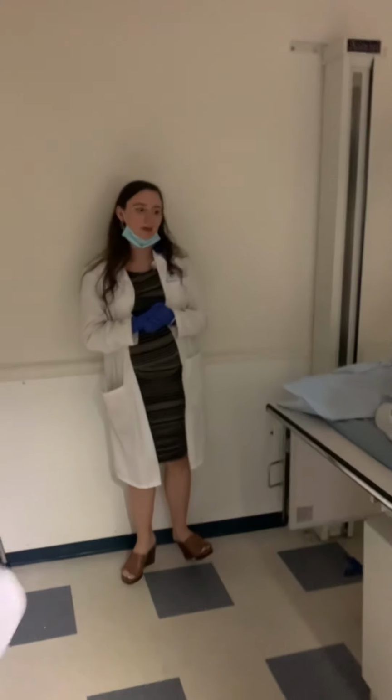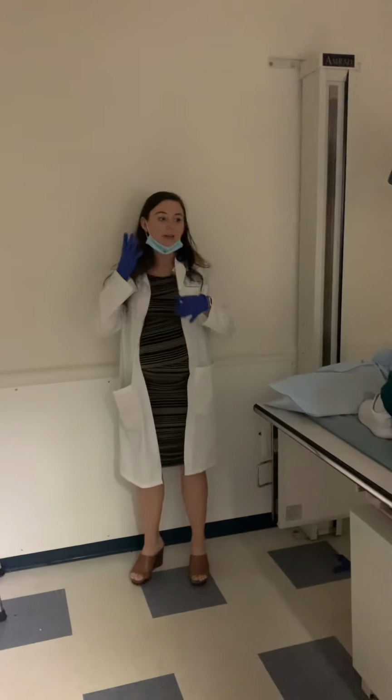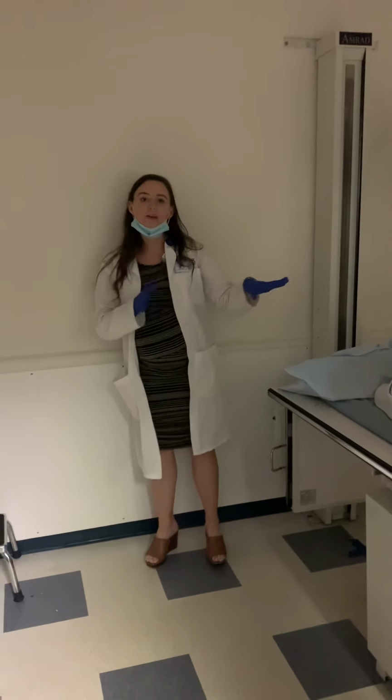Upper gastrointestinal study. So this is what we're doing. This is considered a fluoroscopy study. So it is a moving or non-stagnant or dynamic image, right? So not a typical x-ray where we just shoot and leave. So hypothetically, this exam would be done under fluoro.